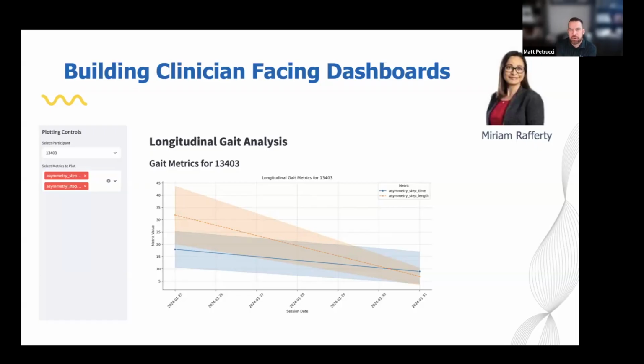Bradley Scott was asking about the monocular pipeline and whether that works without sensors, confirming that it is pure. Yeah. And the workbooks we'll go through in a few minutes. Most of you don't have our app, so you won't have sensor data from the phone. That does help to disambiguate things. As I mentioned, we've done some work using SLAM. In the end, it hasn't made it into the paper because we couldn't quite get the 3D positional tracking accuracy as high as we'd like.